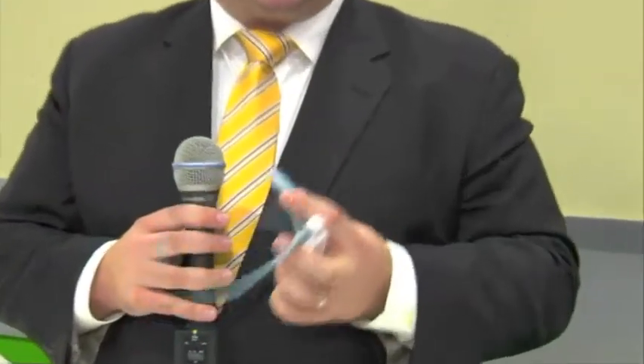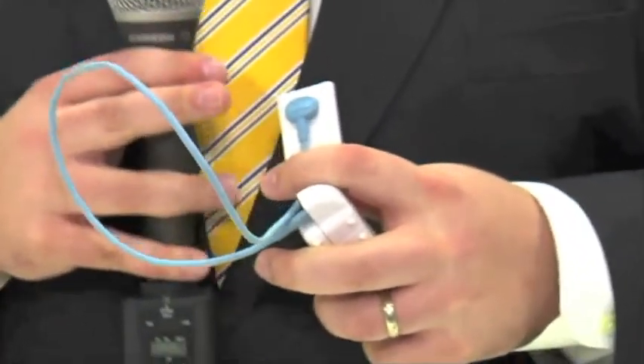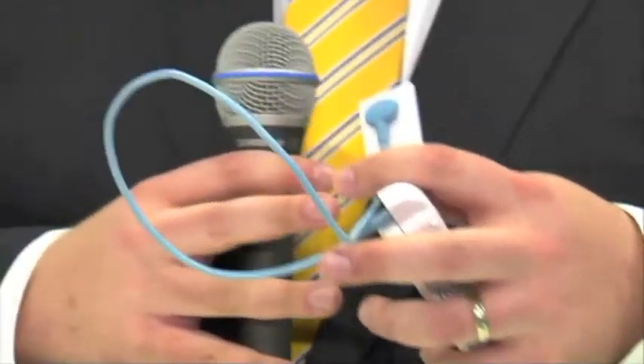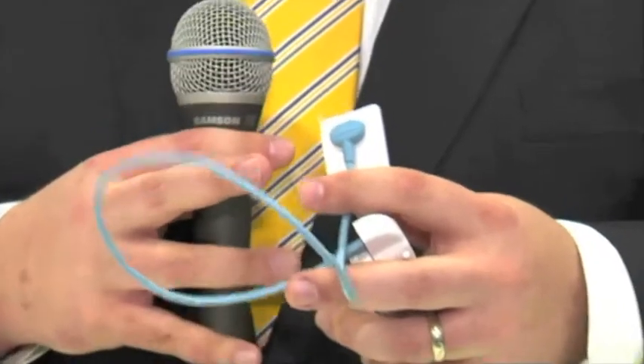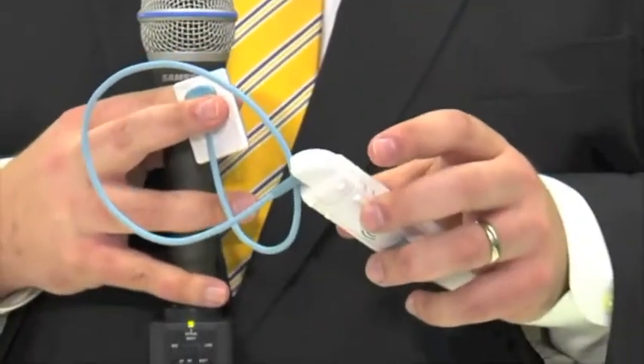The great thing about the Schick Wi-Fi product is it really takes advantage of the Schick Elite sensor launched back in 2009 and its replaceable cable technology. The ability to replace the cable not only provides great return on investment, but also offers serious options in terms of going with three-foot, six-foot, or nine-foot cables depending on operatory size. For existing Schick Elite customers, they can simply take the cable off the back and convert their system to Schick Wi-Fi today.